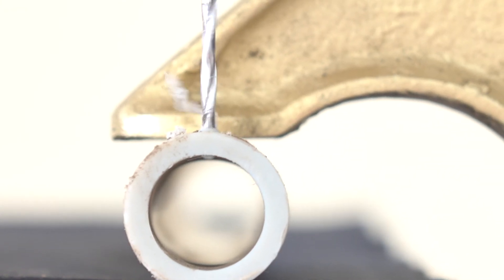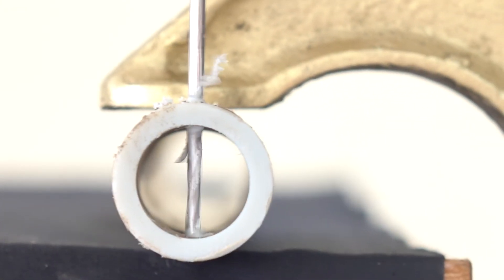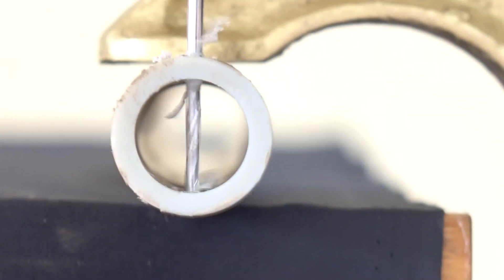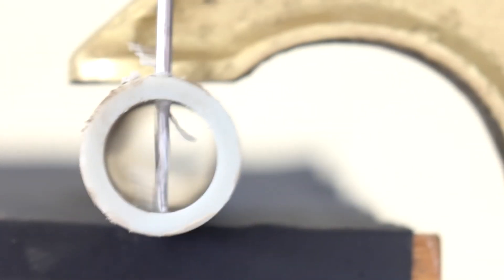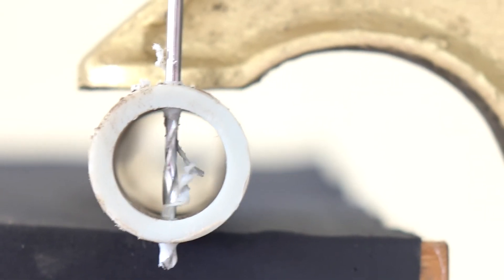Once through the first cortex, you will see that the drill will pass quickly through the intramedullary canal and then engage the far cortex. As you drill through the far cortex, the drill will again give when it clears the far cortex.